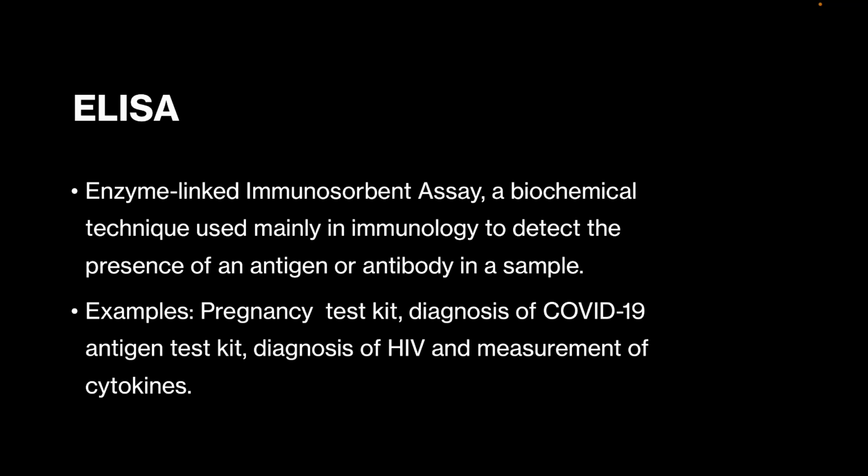If a woman is pregnant and you pass the sample through it, the protein that is present will bind to the antibody and then you see a line. But if the woman is not pregnant, that protein is not present, so the antibody has no protein to react with, and we see no test line.